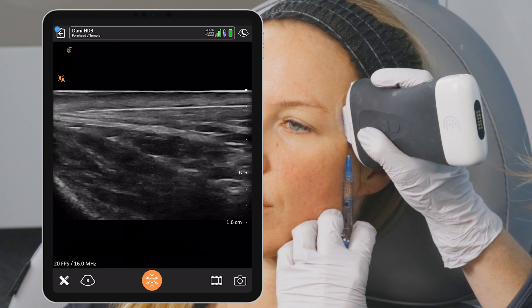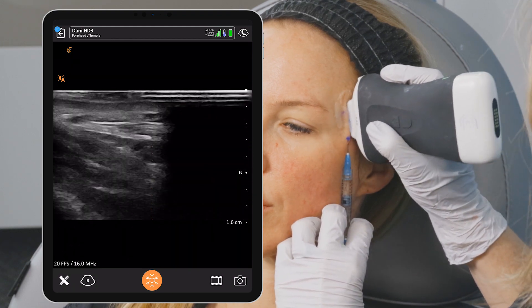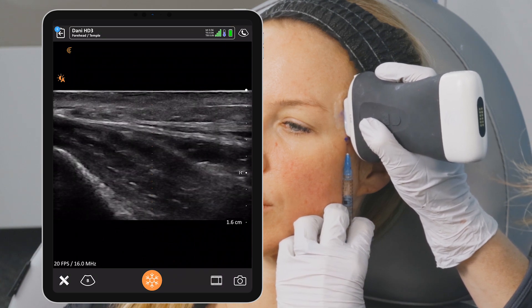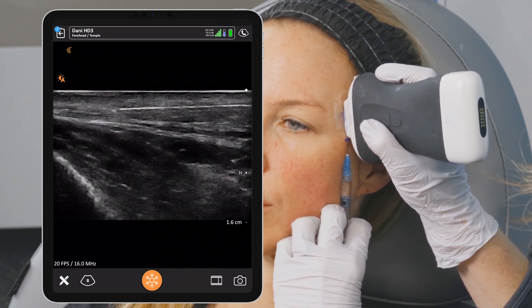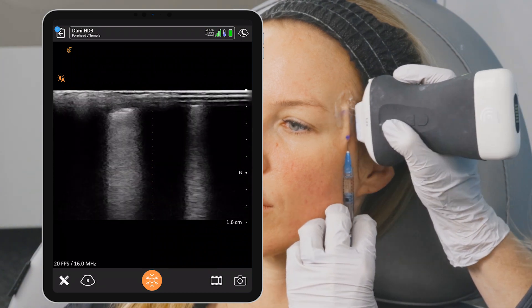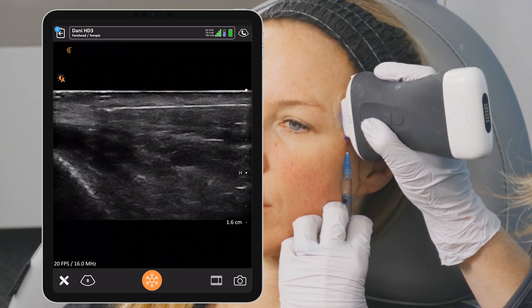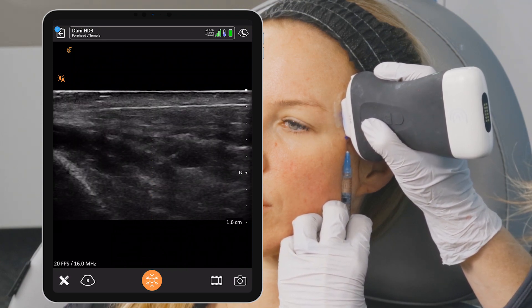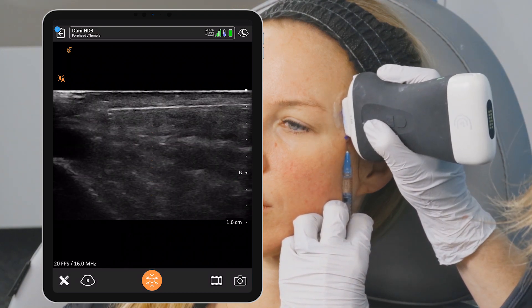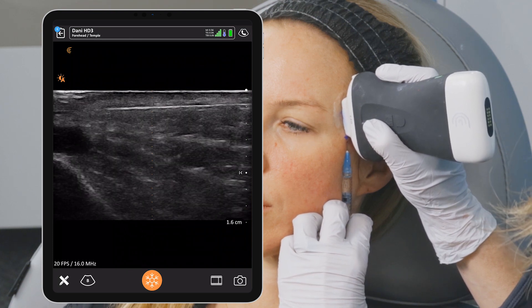It's really that superficial layer, so I'm going to roll my probe right over and make sure I'm nice and superficial above the layer of the artery — in that sub-Q layer, just like I want to be. You can see that visual of the cannula in that layer 2 sub-Q plane, just like we visualized right before.